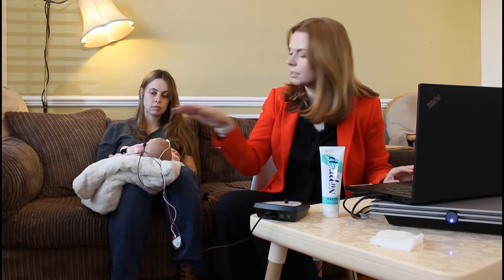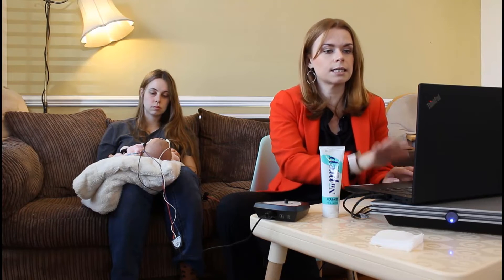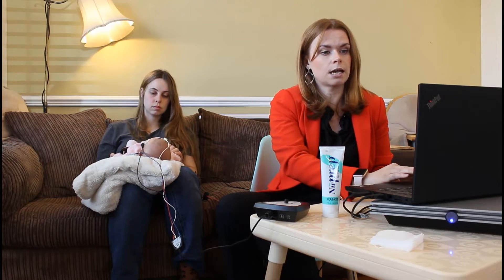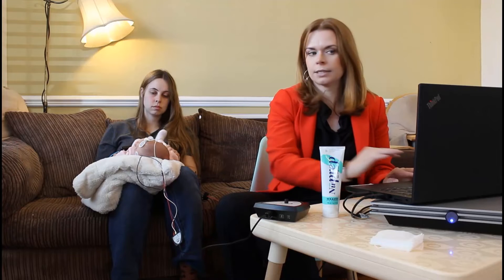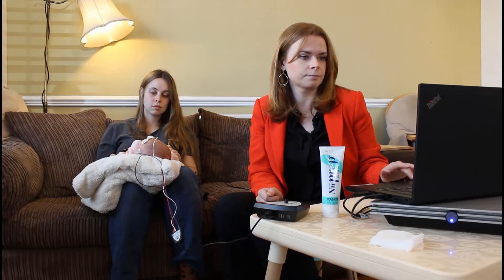We've gone for the left ear because that's the ear pointing up and she seems nicely asleep. My EEG is quite calm despite little wriggles. We'll give her a couple of seconds to settle back down again, and I think we're good to start testing.